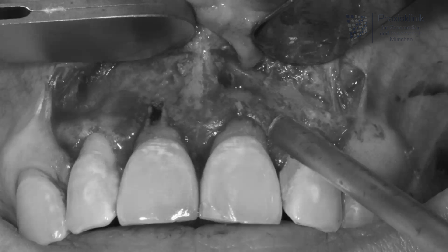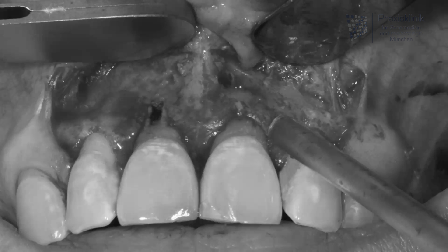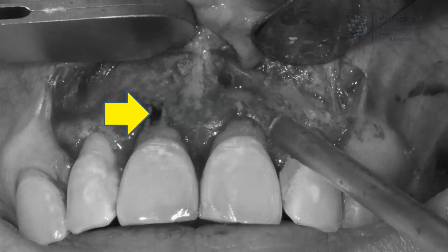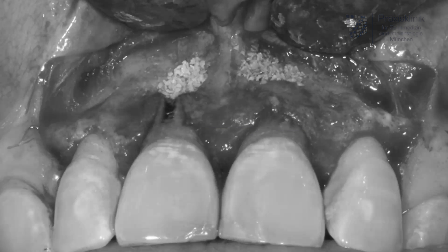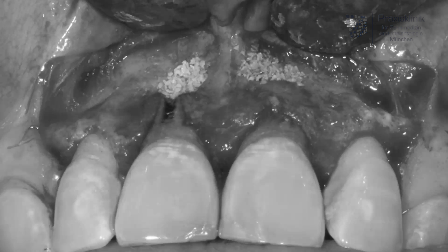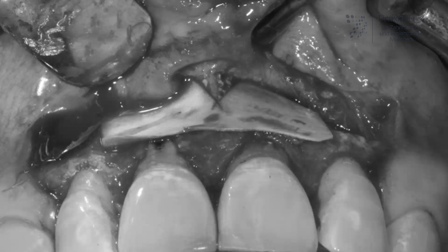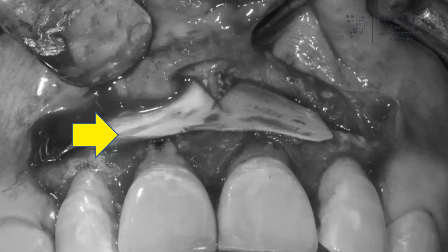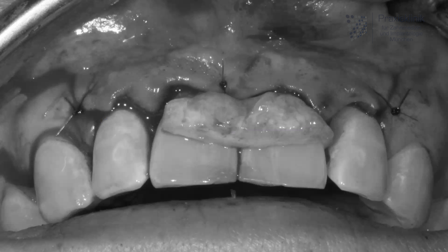After that, you can fill the holes from the drilling where the inflammation has been with artificial material. Here you can see again the MTA indicated with the yellow arrow, and here the holes filled with bone grafting material of bovine origin. After filling the holes, we place a membrane — indicated here again with a small yellow arrow — which stops soft tissue from growing back into that area.